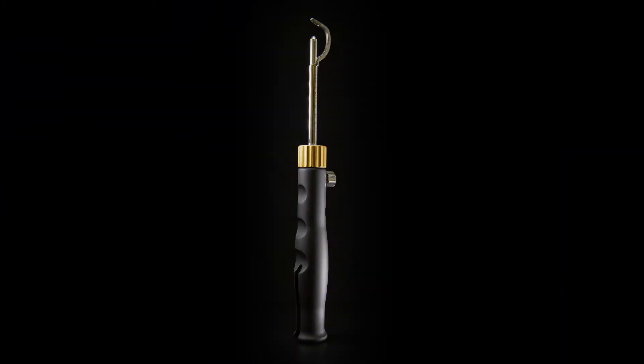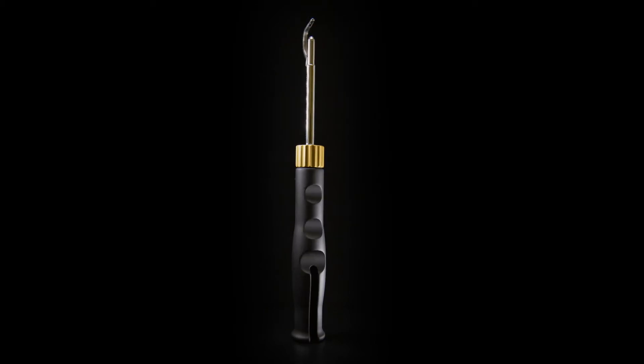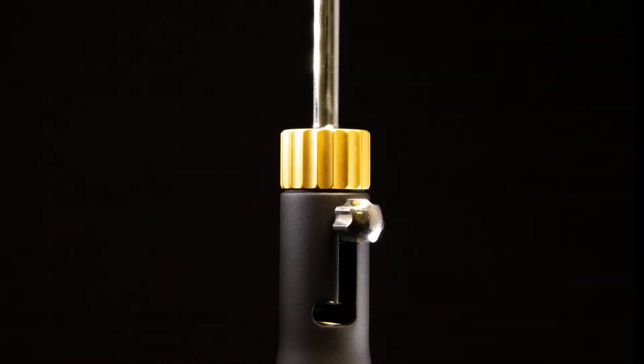Tensor Surgical's Transosseous Arthroscopic Rotator Cuff Repair System can fix any cuff for the price of one anchor.